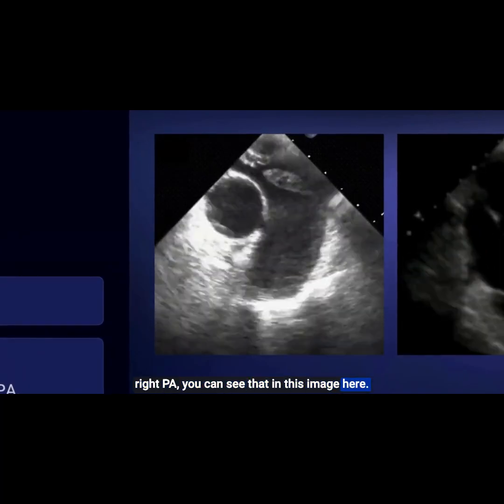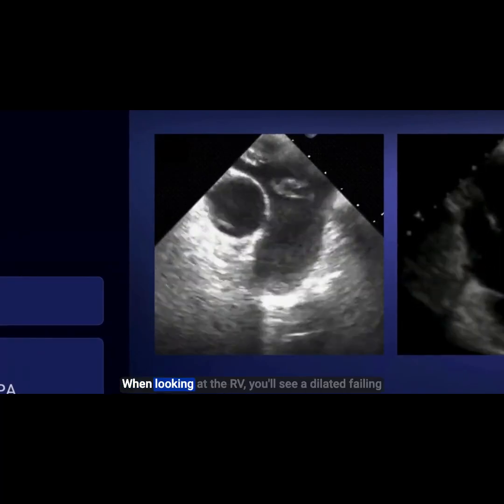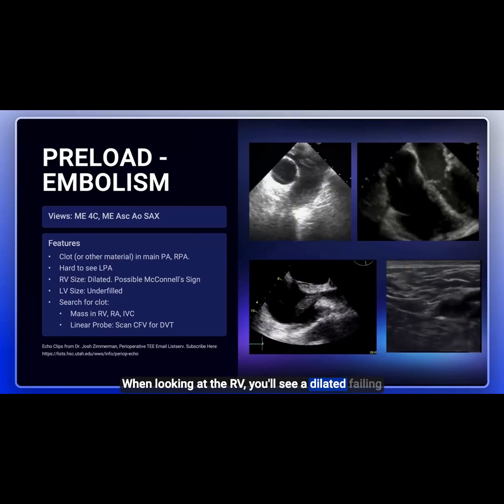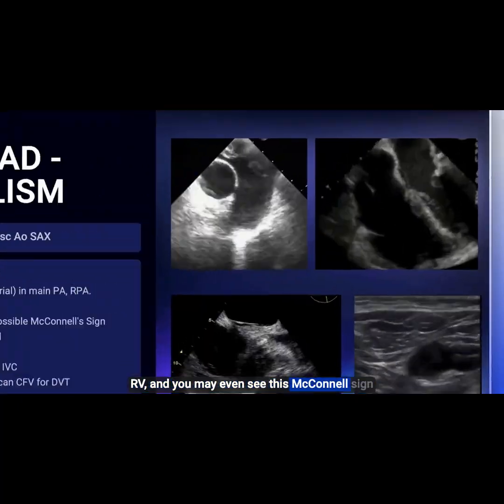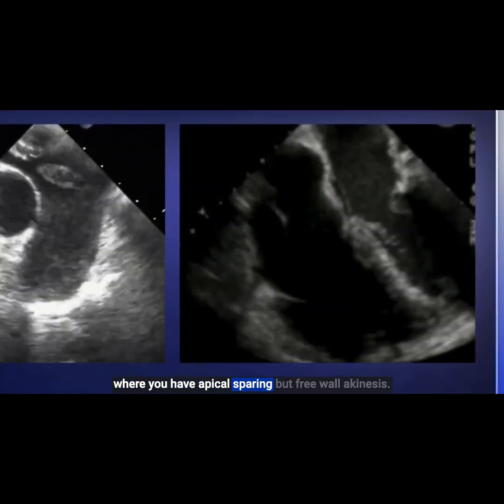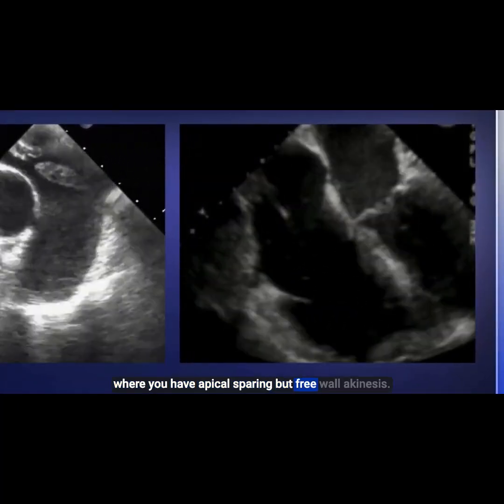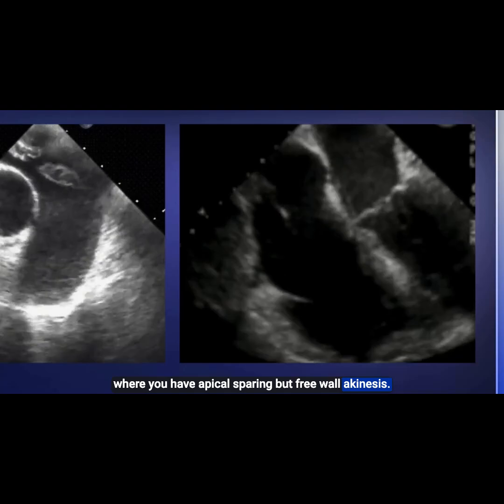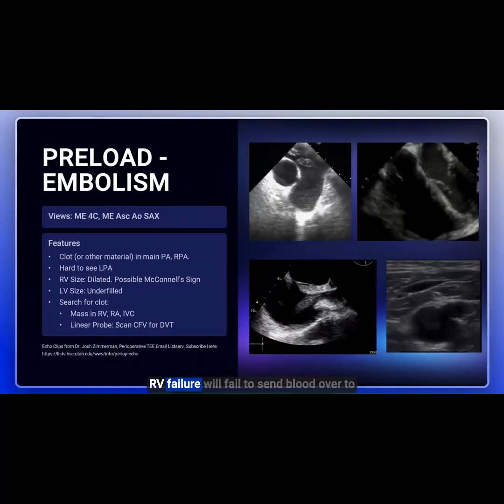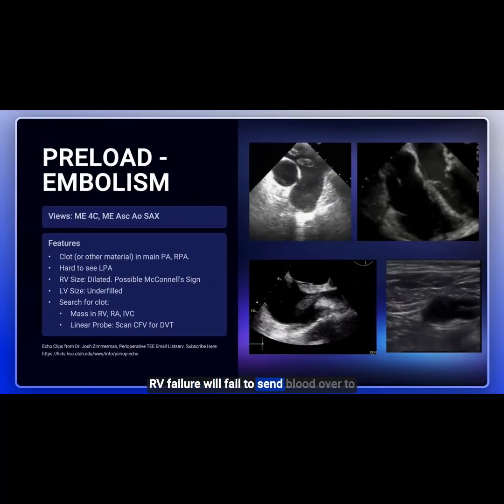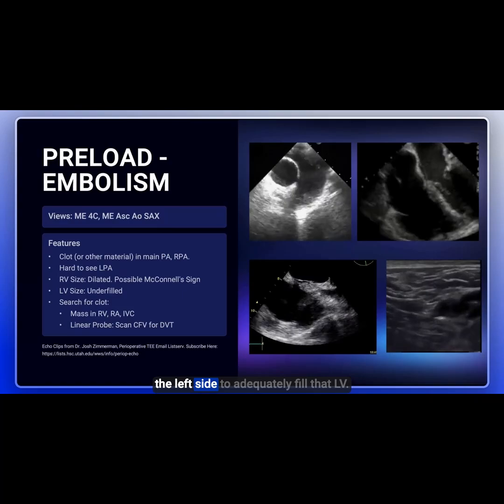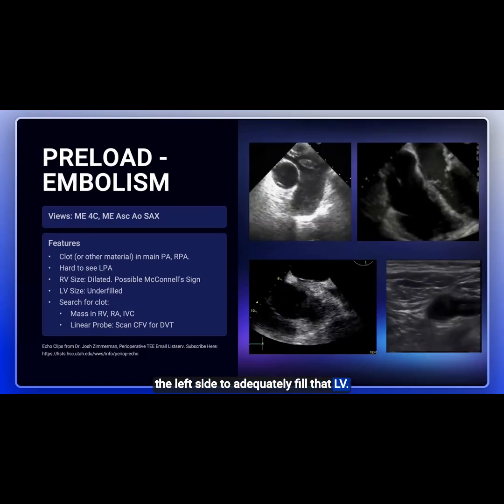You can see that in this image here. When looking at the RV, you'll see a dilated failing RV and you may even see the McConnell sign, where you have apical sparing but free wall akinesis. The LV will be underfilled because the RV failure will fail to send blood over to the left side to adequately fill that LV.